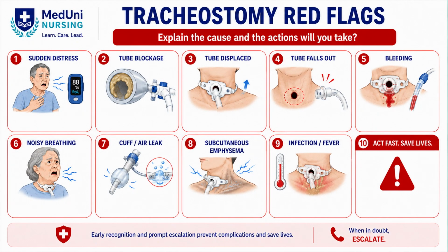This is a high-risk slide. Pause and ask, is the patient suddenly distressed? Is the oxygen saturation falling? Is there noisy breathing, reduced air entry, or increased work of breathing? Think blocked tube, displaced tube, or airway obstruction. A mucus plug can be an emergency.